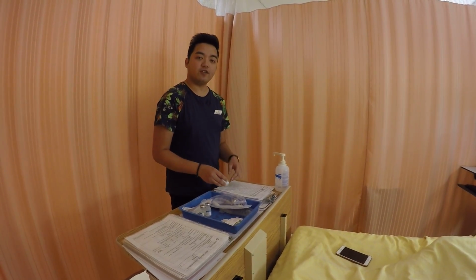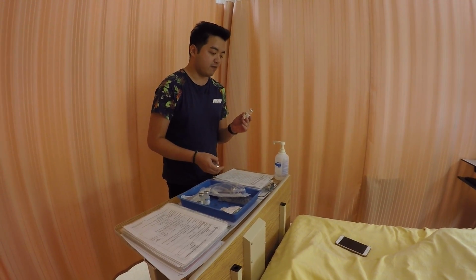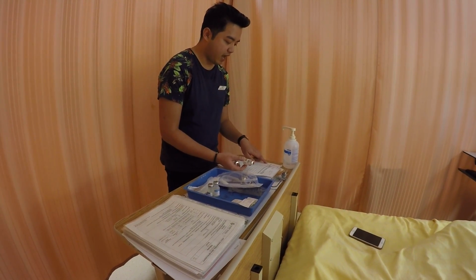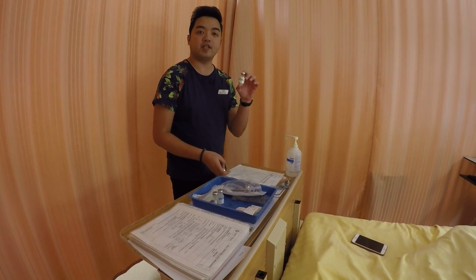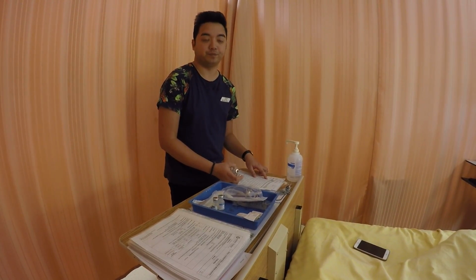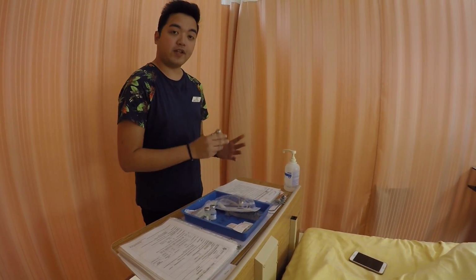When I'm pulling out the medications, let's say I already have the cefoxitin, I am doing my first set of checks. Just make sure it's cefoxitin for Mrs. De La Cruz, 1,500 mg, IV, the time is now, and every 8 hours. Since cefoxitin comes in a 1 gram vial, I need to get 2 vials to be able to get the 1,500 mg dose. And now I'm ready to prepare.